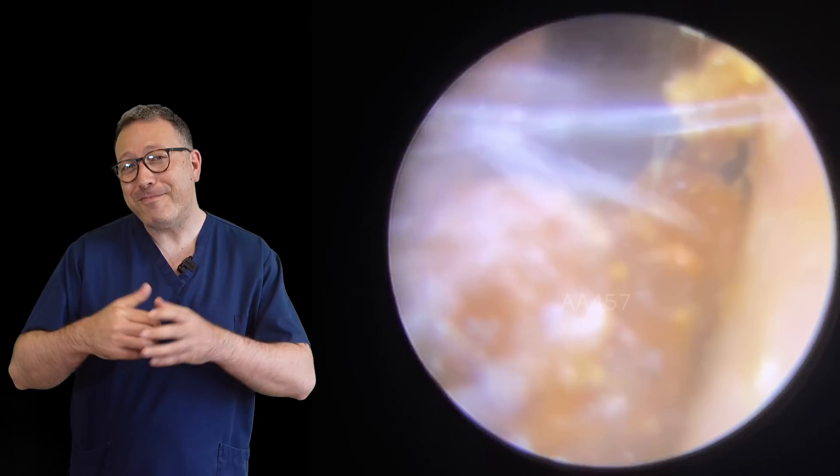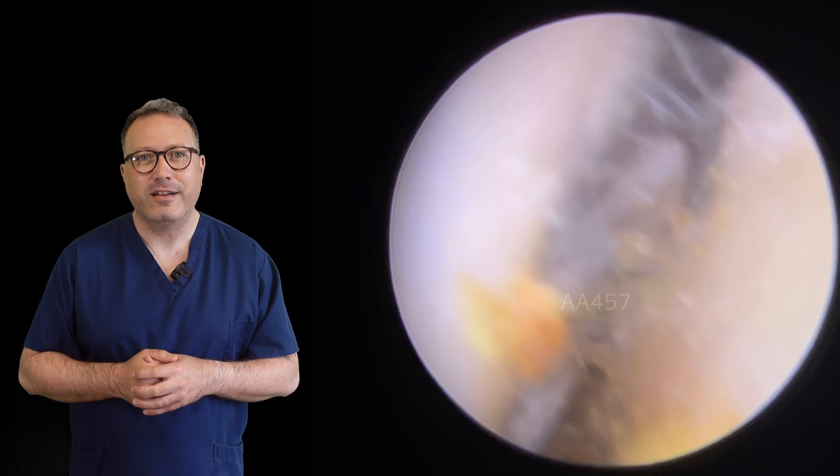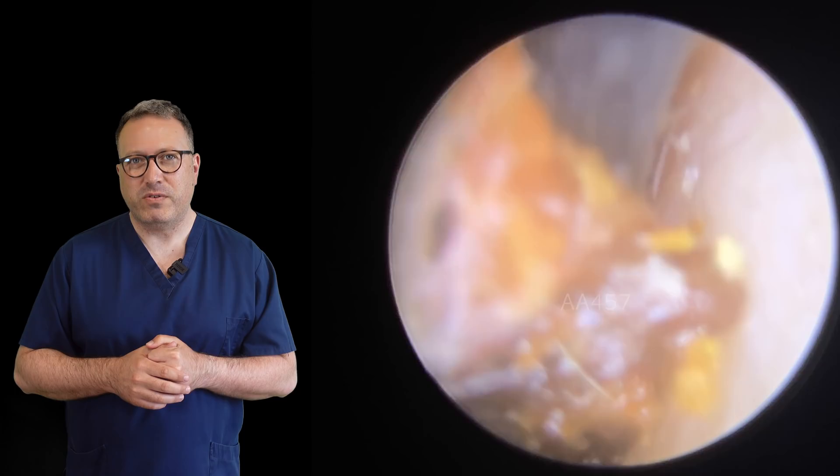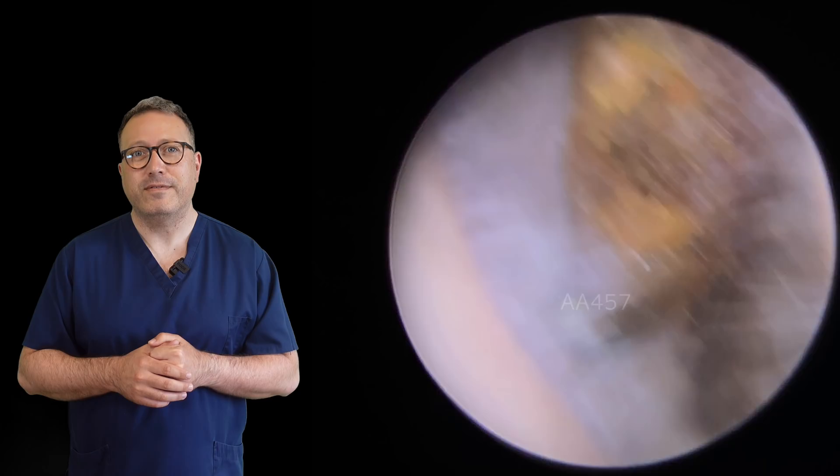We're going to roll it out into the bowl of the ear. There's a little bit more in there — let's drop this section forwards. There'll probably be a few little remnants left behind, so we'll probably have to use a little bit of suction to tidy up afterwards. But doing quite well there, getting all this out using the Jobson horn. You can see there's still some quite big chunky bits in there.